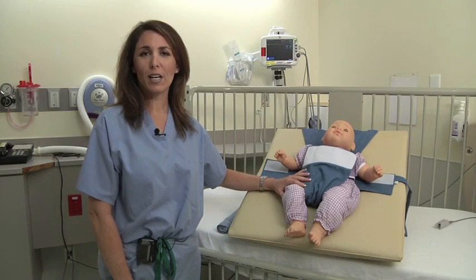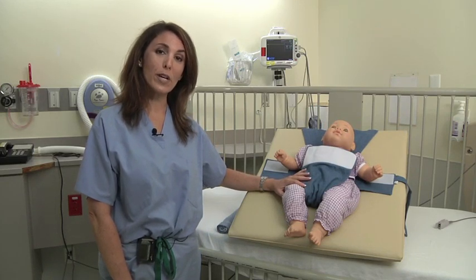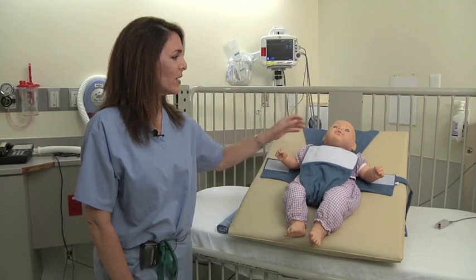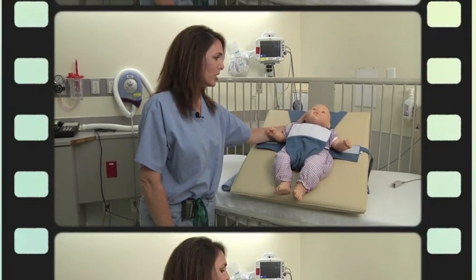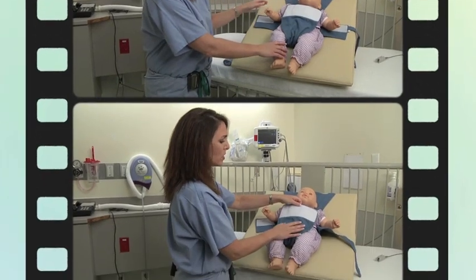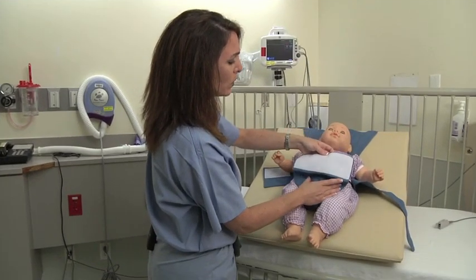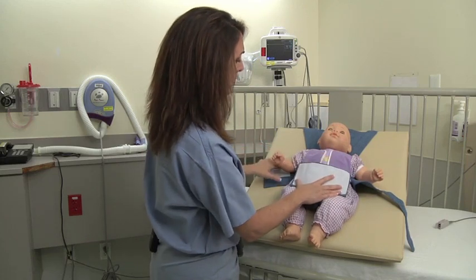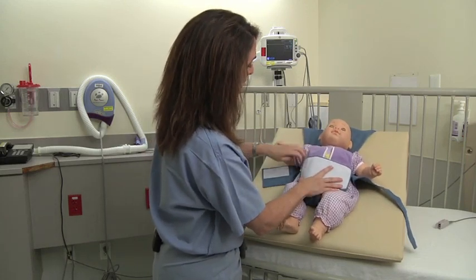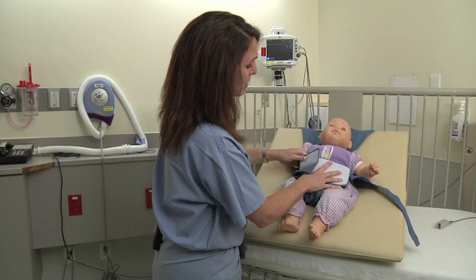Now we're going to talk about the supine or back-lying side of the rescue wedge. This side has the nest, or the scooped out side of the wedge, in it. First thing you're going to do is fold the crotch flap down just a little bit like so, and then you're going to take the side flaps and meet the middle flap.